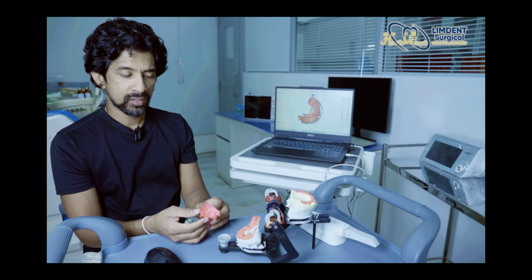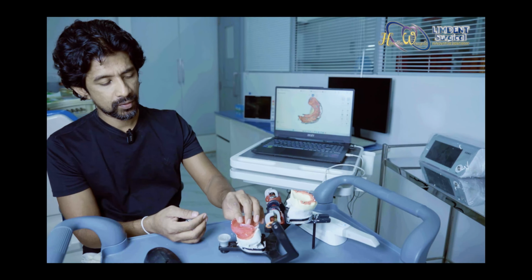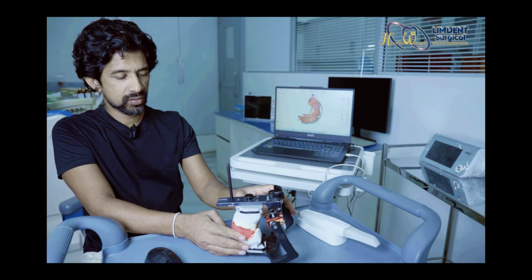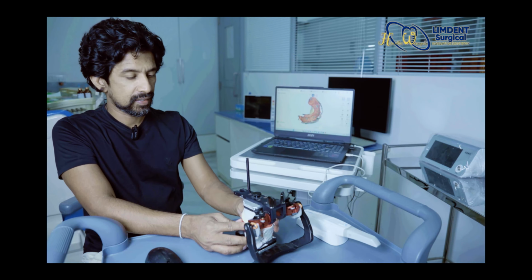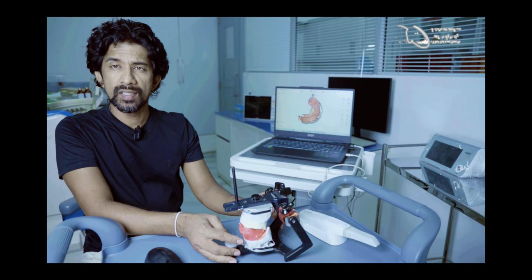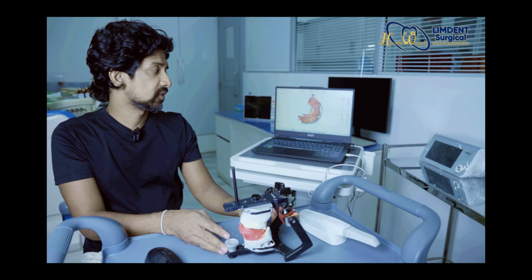On the other hand, some of the software will recognize that this bite registration will be kept on the models and closed in the desired position, and then you'll be scanning that as a normal bite registration, like we do for dentate patients when they are keeping their teeth in contact.